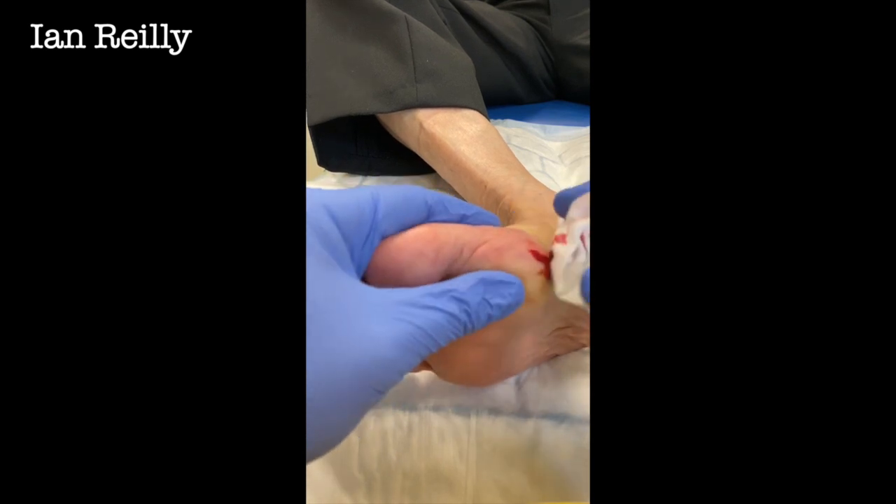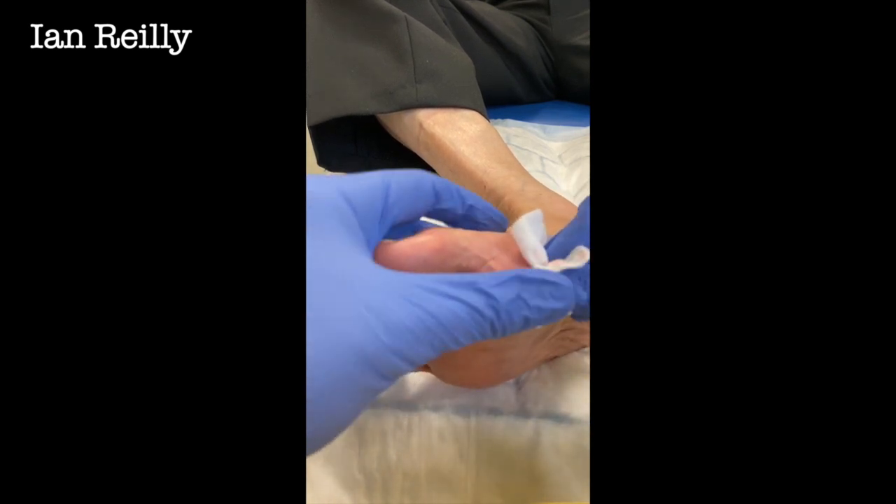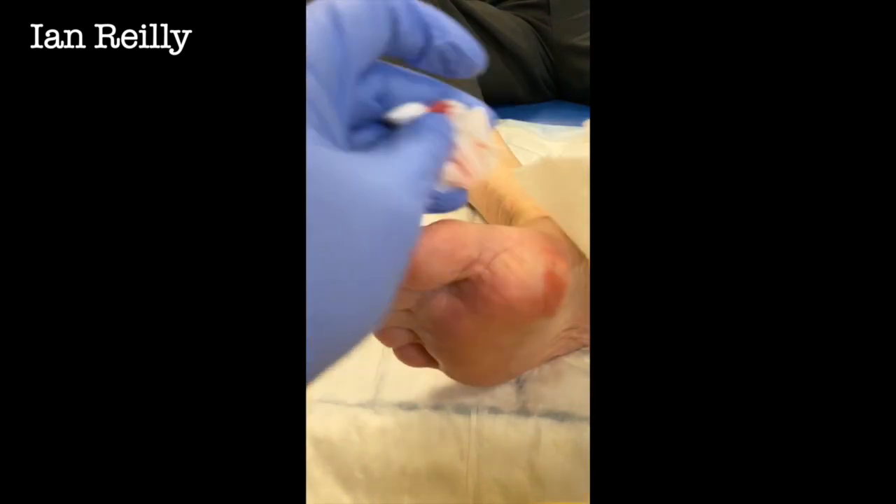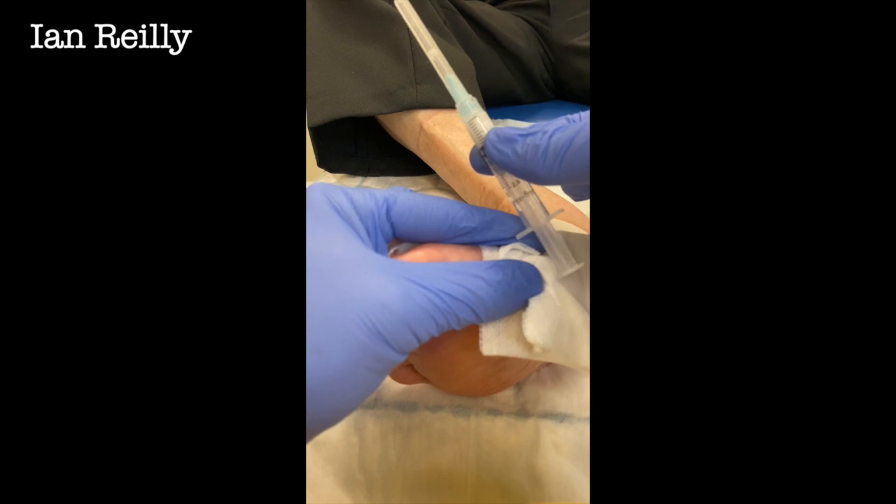So that's decompressed it quite a lot, but really all blood. I'm now going to pop in a little bit of cortisone just to try and take care of some of the residual inflammation around that.